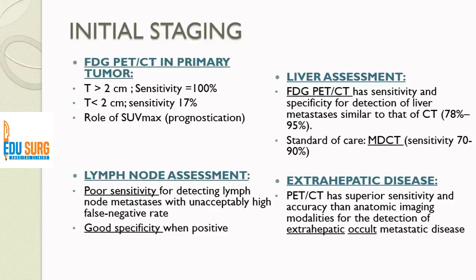Also, PET-CT acquisition is a prolonged acquisition. The patient is in a free breathing state, not in a breath hold state. So there is continuous movement of the liver because of the diaphragmatic movement, and there are a lot of blurring and truncation artifact in the liver area. So that can cause the sensitivity to drop a little when it comes to small tumor metastases.